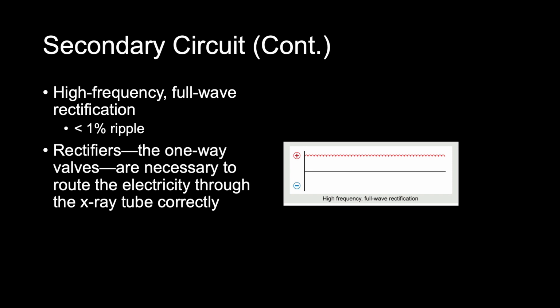It is again passed through rectifiers where it is again fully rectified, and finally through high-voltage capacitors where it is smoothed to provide the X-ray tube with a near constant potential voltage waveform. These generators reduce the ripple that is seen by the X-ray tube to less than 1%.